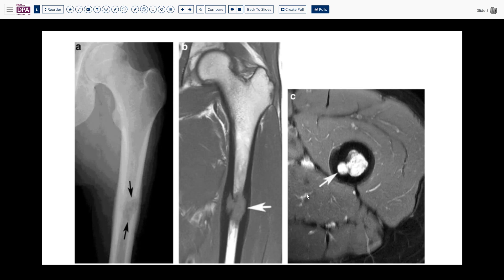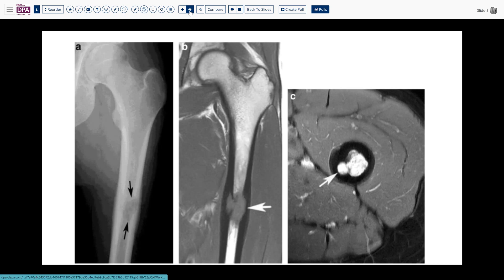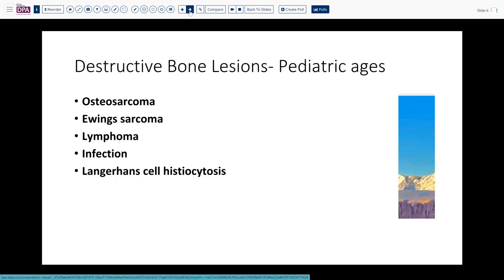The other MRI image shows brightness and illustrates variable heterogeneity within the lesion, indentation into the cortex, and some highlighting of the periosteum with extension around it. Radiographically, this has the appearance of a potentially aggressive lesion, with irregular boundaries, destruction and fuzziness, elevation of the cortex. So what do we think about when we see a potentially aggressive or destructive bone lesion in a pediatric patient?